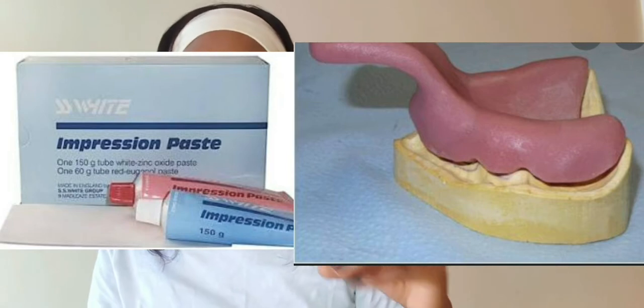The special trays are normally either perforated or not perforated. Sometimes they're underextended. I don't want to go into detail because this is not your scope of work, but if they're underextended, you may have to add material around your special tray, or the dentist has to add material around the special tray to make it adapt better to the patient's oral cavity. Okay, and then from there, impressions are sent back to the lab.